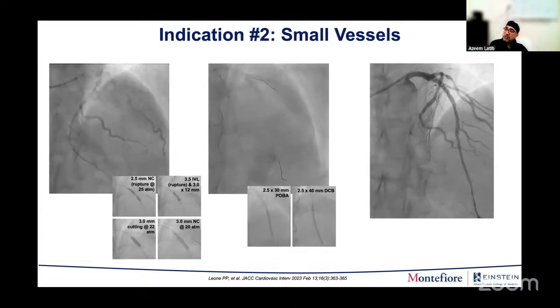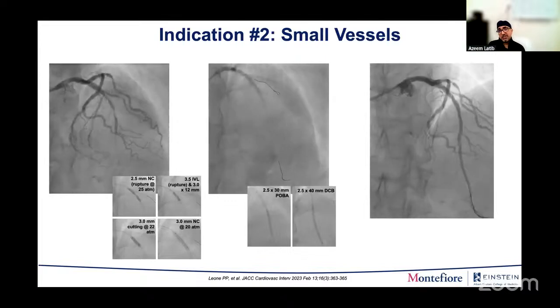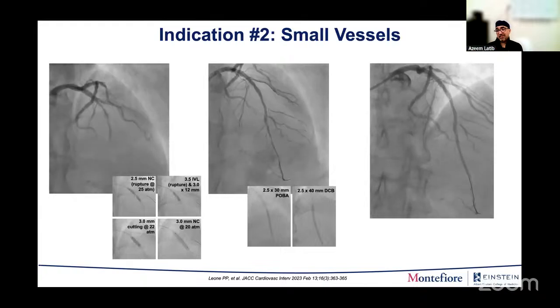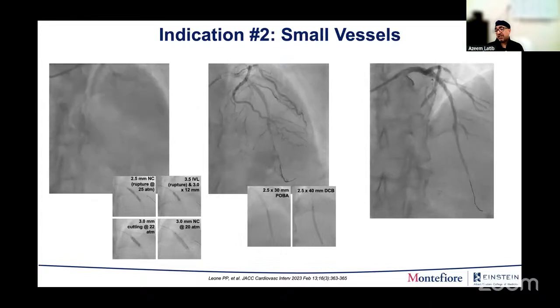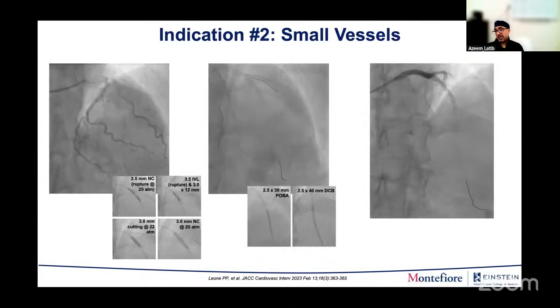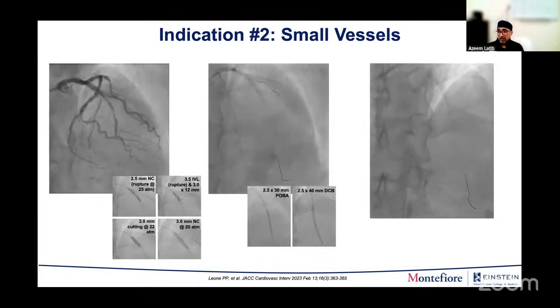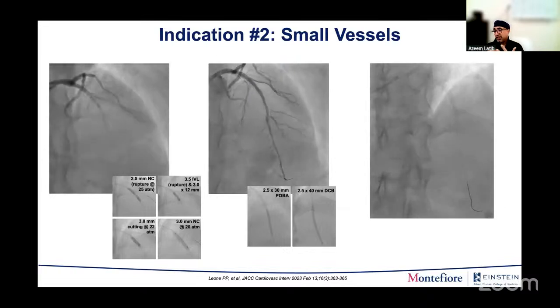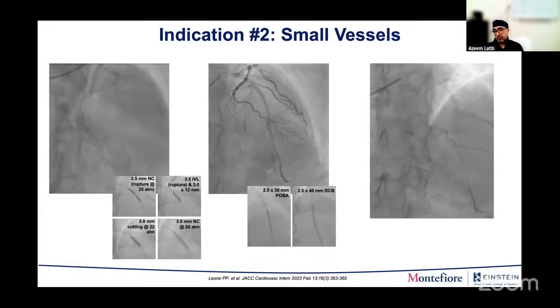Nowadays, compared to when we were doing balloon angioplasty years ago, before stents, remember, DAPT only came around after stents were being implanted. The first stents were implanted without DAPT, and balloon angioplasty was done without DAPT. It was done keeping patients on warfarin and aspirin, and sometimes we would use even more toxic drugs to keep them anticoagulated after a balloon angioplasty procedure.